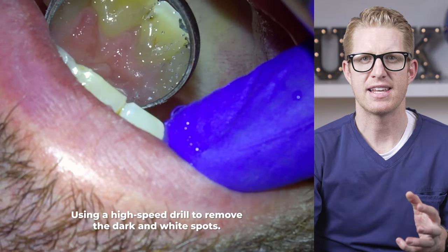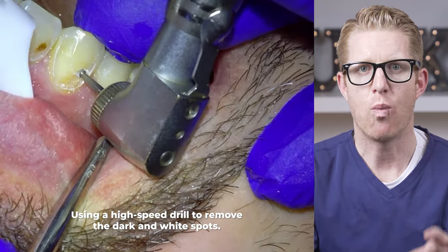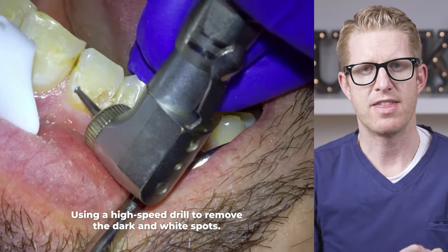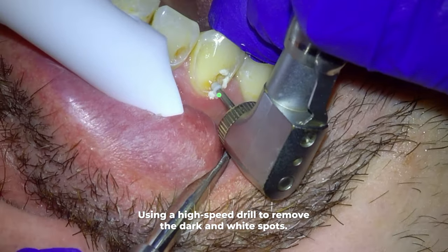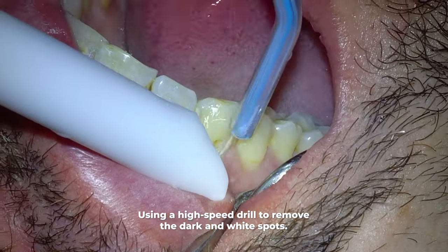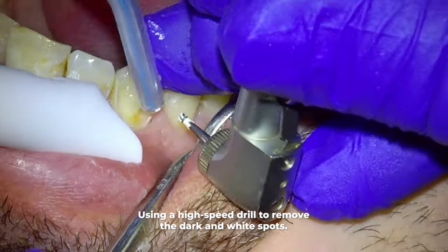Once we remove all the white demineralized enamel layer, the underlying yellow layer called dentin is exposed. Where the active decay was on the enamel, you'll notice there's discoloration underneath as well. The more healthy dentin has a yellow look to it. On this canine the dentin has an orangey look, and on the other tooth the dentin is still dark underneath. Both the orangey and dark look to the dentin are tooth decay that has made its way into the dentin level, and we're going to remove all that in a moment.